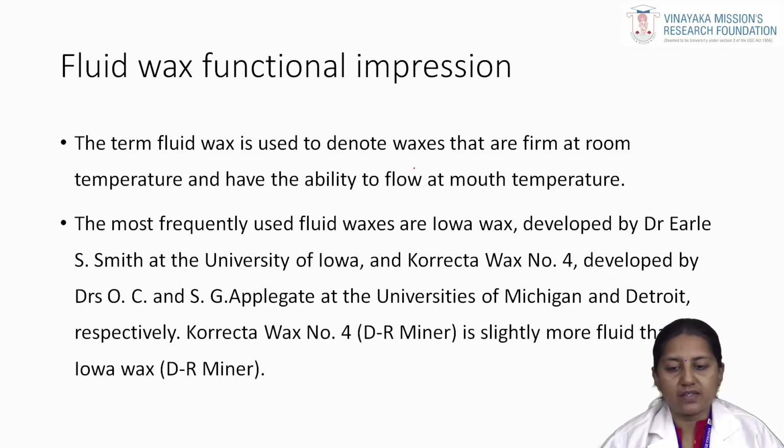The term fluid wax is used to denote waxes that are firm at room temperature and have the ability to flow at mouth temperature. So what are the waxes you use? You have Iowa wax that was developed by the University of Iowa, and you have the Correcta wax which was developed by Applegate at the Universities of Michigan and Detroit. The Correcta wax number 4 is slightly more fluid than the Iowa wax.